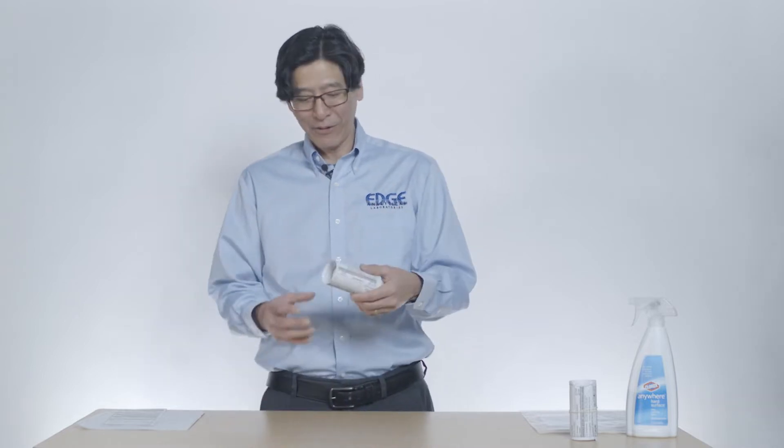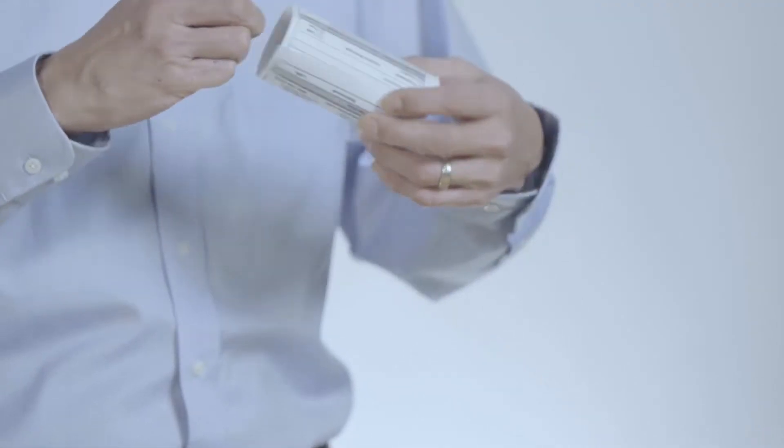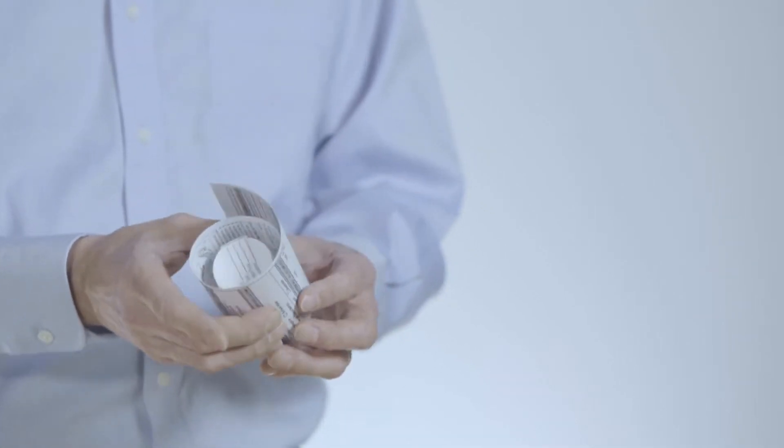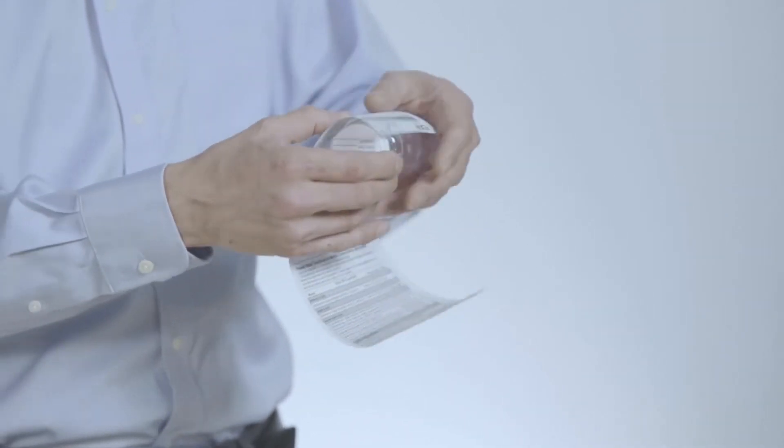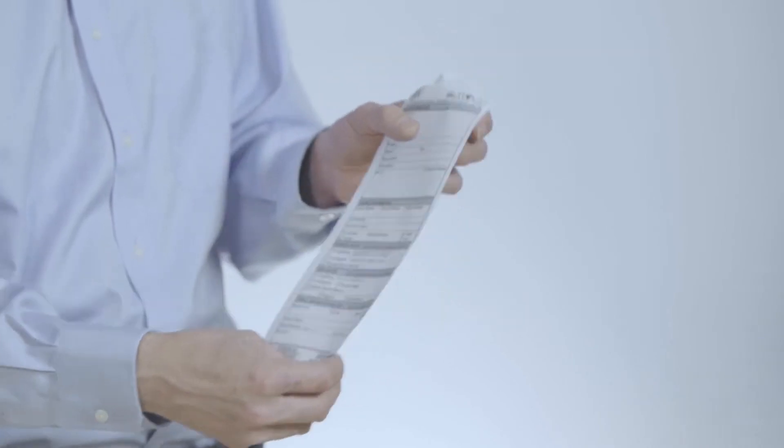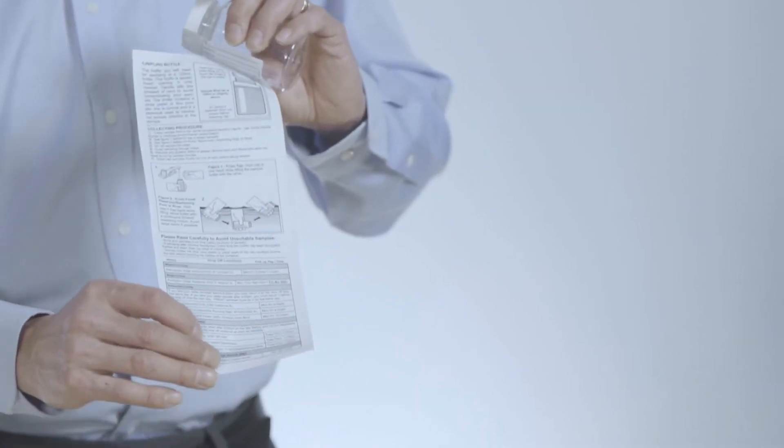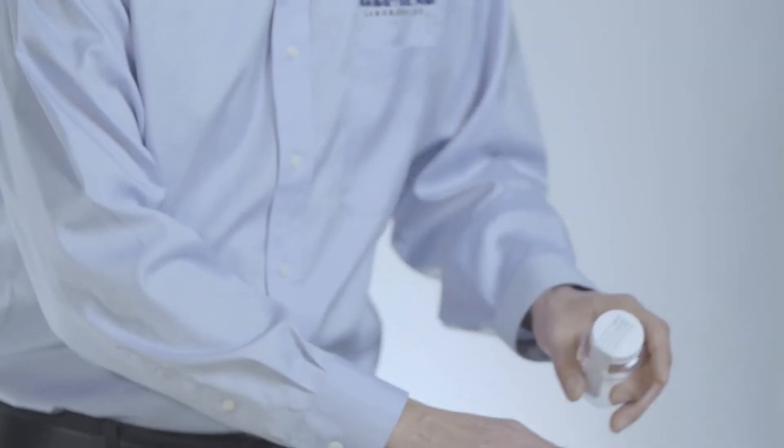When you come to our lab, you'll get this sample bottle with paper wrapped around it. The paper is for you to fill out with all the information for your water system. It also has instructions on the back, so this will help clarify if you have any further questions.